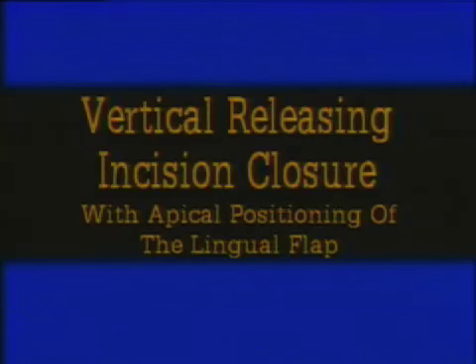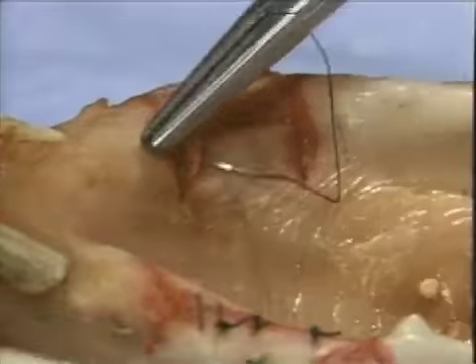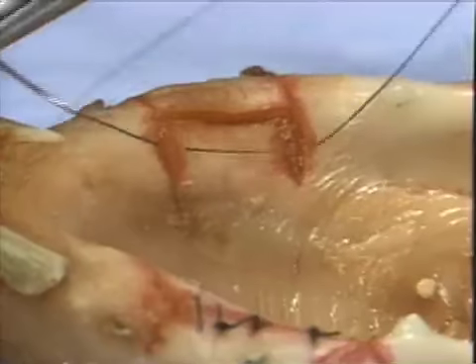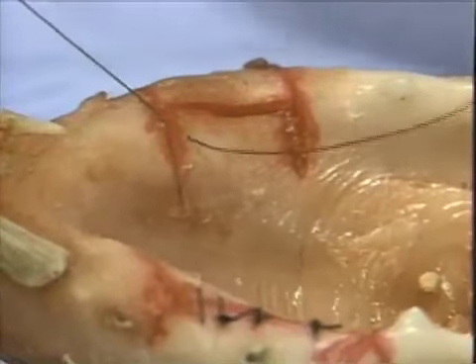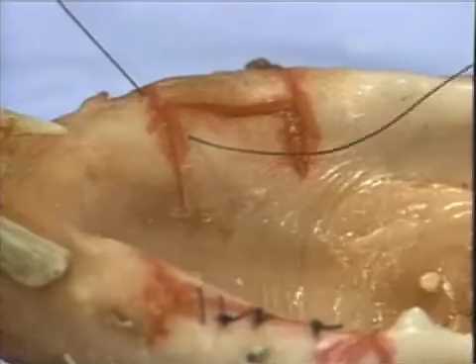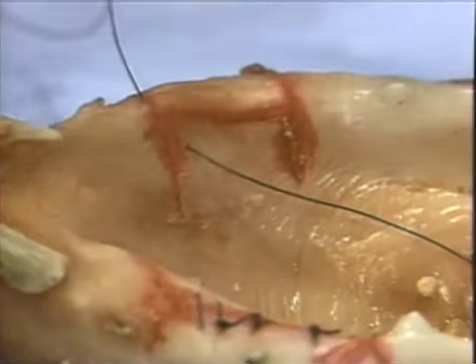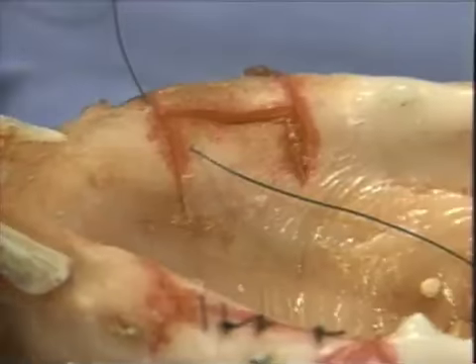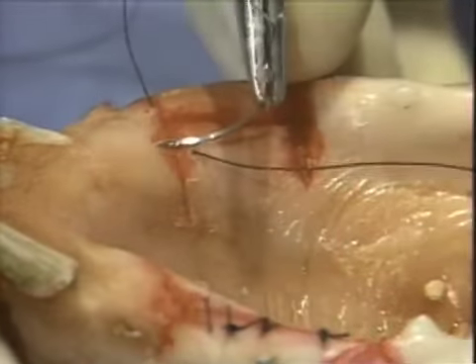We'll now demonstrate closure of a vertical releasing incision with apical positioning of the lingual flap. The suture is always advanced through the movable portion, that is, the flap itself. We will be moving our suture from the movable tissue of the flap to the stationary tissue which surrounds the flap. In this way, we can let the suture determine the eventual position of the flap.